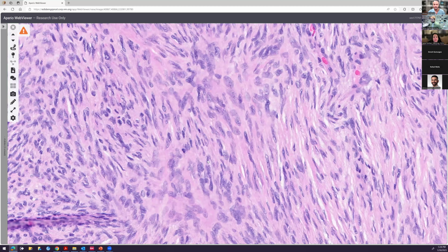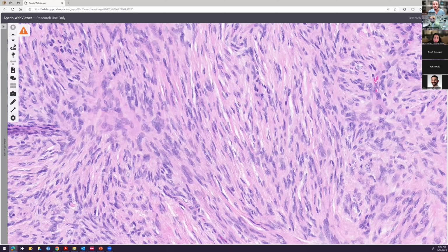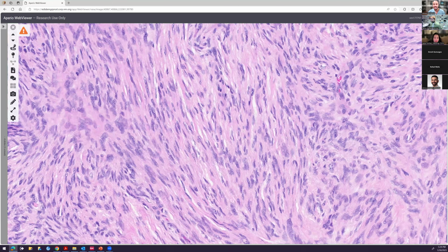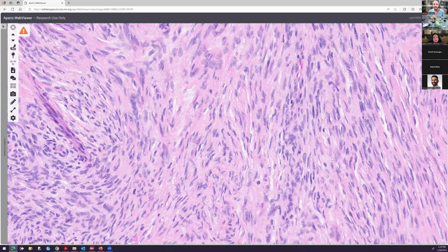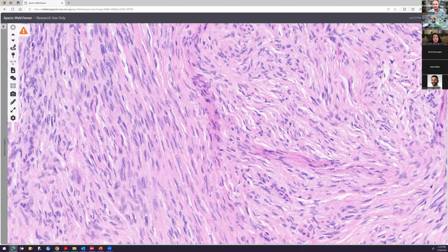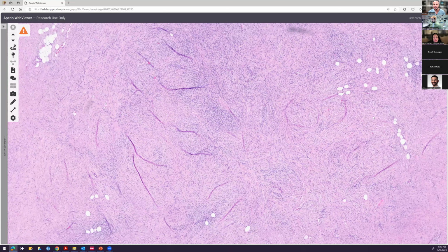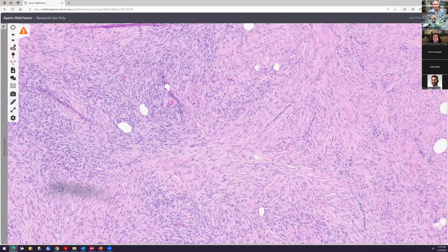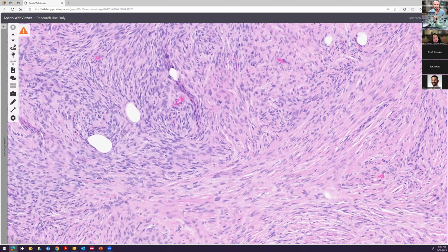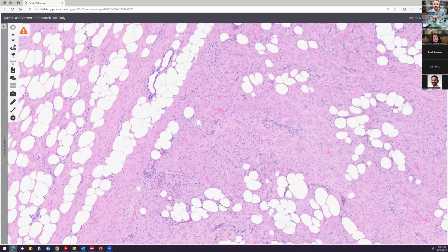Okay, let's talk about cytology. What do you think? Yeah, looking at the cytology for these cells, it looks like a fibroblastic, myofibroblastic lesion. I see these bland spindle cells. Okay, pretty nondescript, bland-looking spindle cells. That's true. They have this open chromatin. I don't see any nucleoli. Okay, yeah, no nucleoli, just somewhat pointy on the ends, and that's it. Okay, fair enough. Some areas are a little bit more cellular, but mostly relatively bland looking. All right, so what are your thoughts? Yeah, I don't see any mitotic figures or anything like that. I don't see any areas of necrosis.